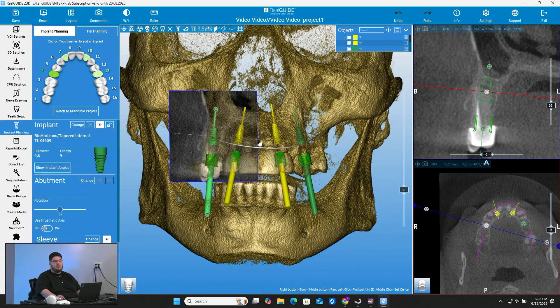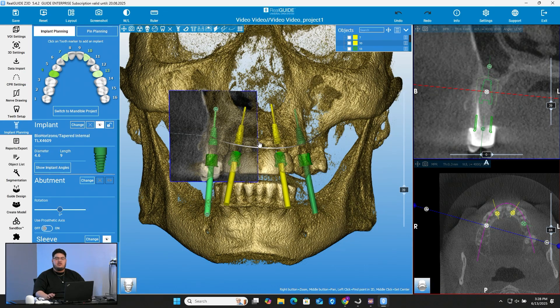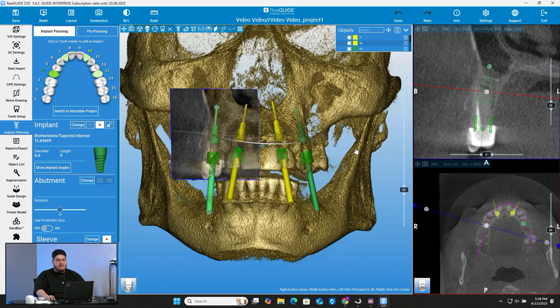Right now I have RealGuide open. This is actually a plan that I already have planned out. We already have the four implants that we want, but what we want to show you guys how to do on this one is just how to take the segmented bone scan or even the jaw scan and make a perfect bone cut aligned to where your implants are placed.